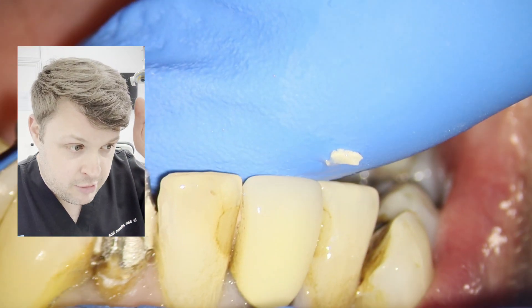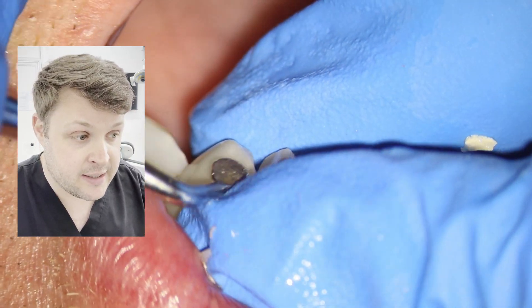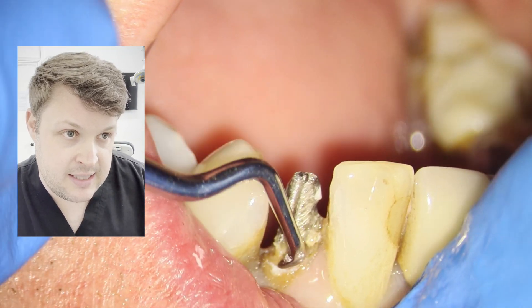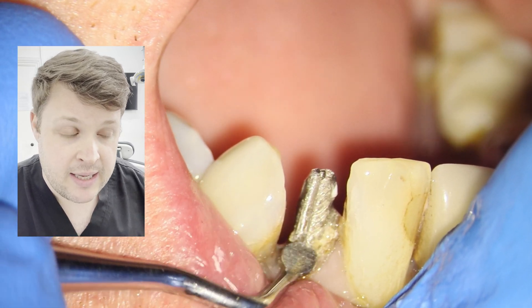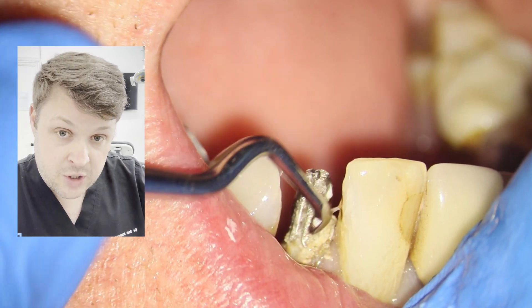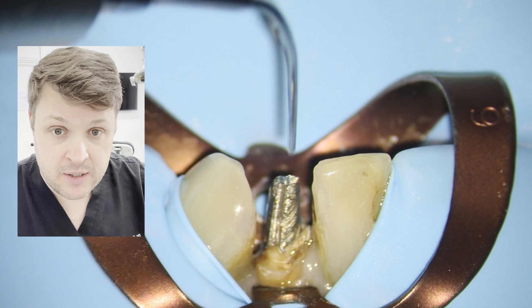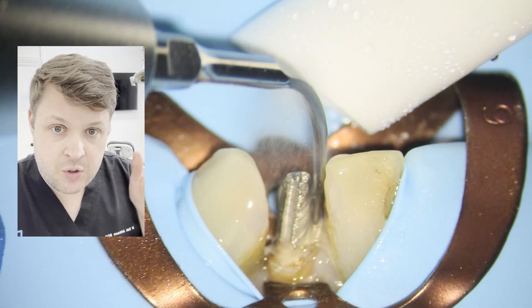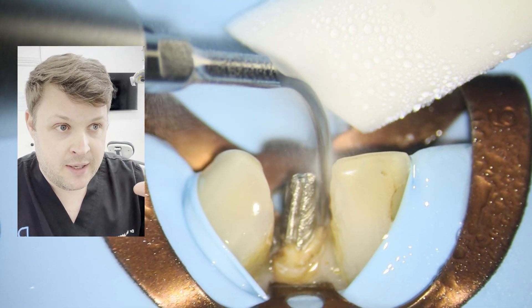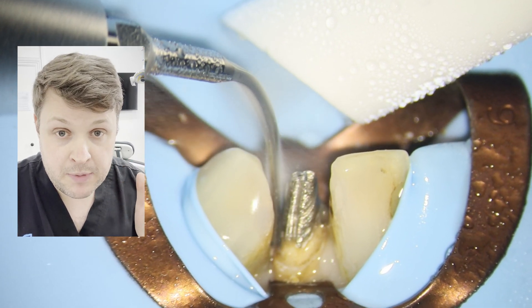You'll notice I've created a small notch in the post. It's not the end of the world and not ideal, but it's not really significant in the sense that it's bad for the patient. The issue is that when you're using the ultrasonics to activate the post, you don't want any bumps — you want it all to be nice and smooth so the ultrasonic tip has maximum contact against the post itself.